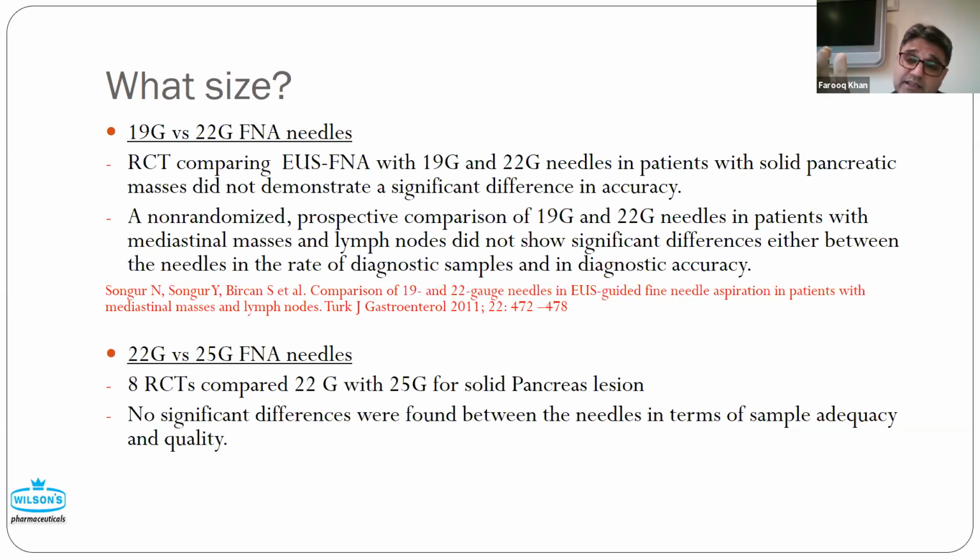Now, if you've taken the scope down to an uncinate lesion, for that matter, or a retroperitoneal mass just around the mesenteric vessel, I still remember that case, you have to go really, really into D2, D3.